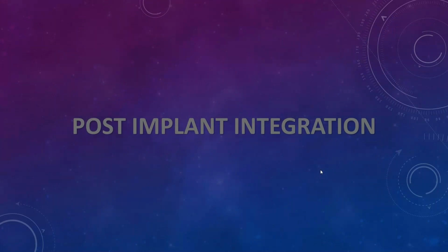Okay. So we went through the process of planning things. We went through the process of scanning, creating surgical guides, placing the implants hopefully in the right position, giving the patient a temporary denture, to where now it's been 2 months to 2 years, depending on what the bone quality is like. When you have less dense bone, let's put it that way, implants sometimes take longer to integrate and they're not as strong. So you want to wait as long as possible before loading them so you don't end up losing implants.